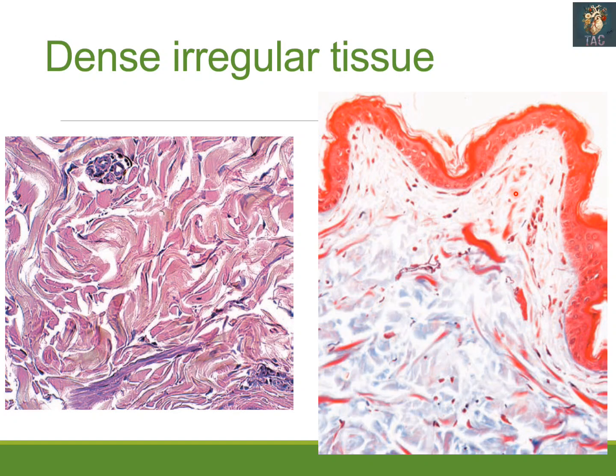In this slide you can see this is the epithelium, then is the loose connective tissue, and then is the dense connective tissue. In this dense connective tissue you can see the fibers stain bluish or violet color in Masson's trichrome stain. So you can also differentiate between the loose and dense. Over here, loose connective tissue has a large number of cells as compared to dense connective tissue, which contains a large number of fibers that are irregularly arranged. Also, the loose connective tissue contains a large amount of ground substance as well.